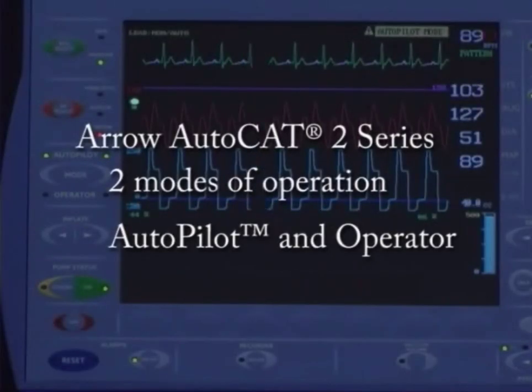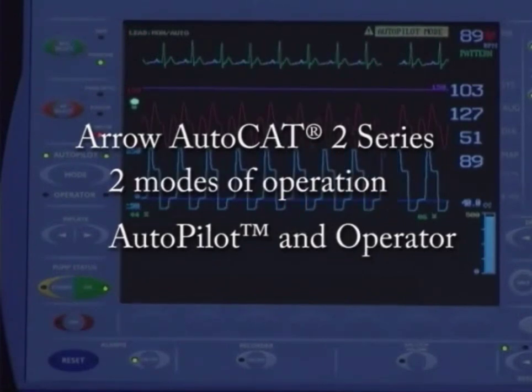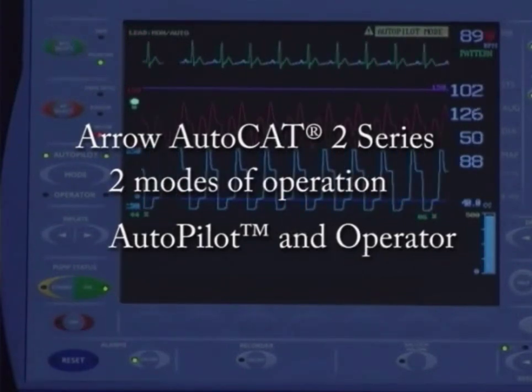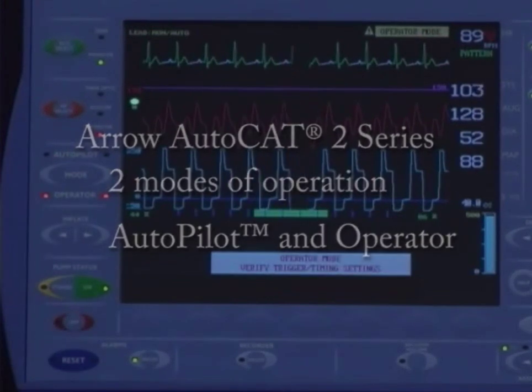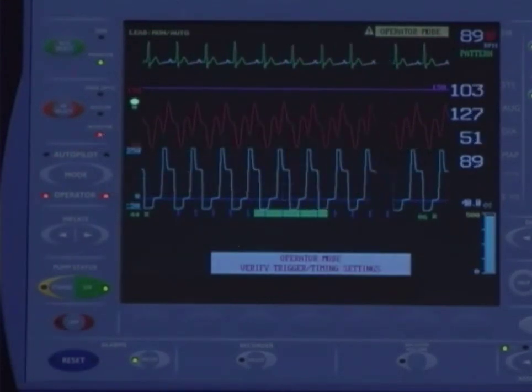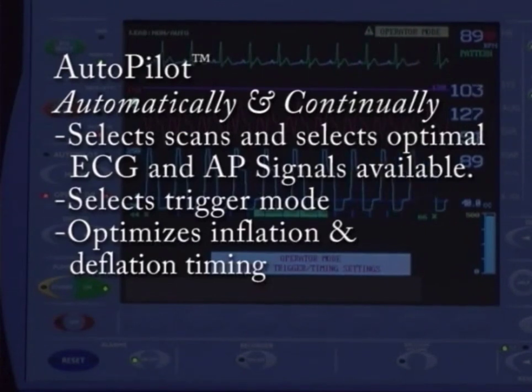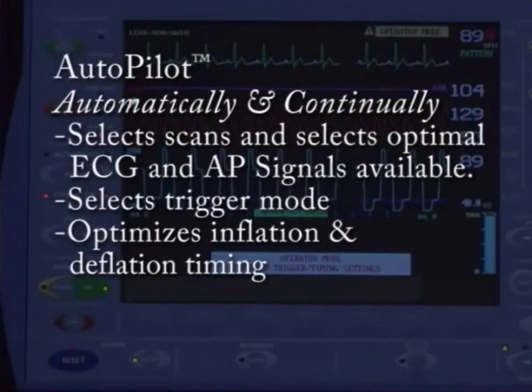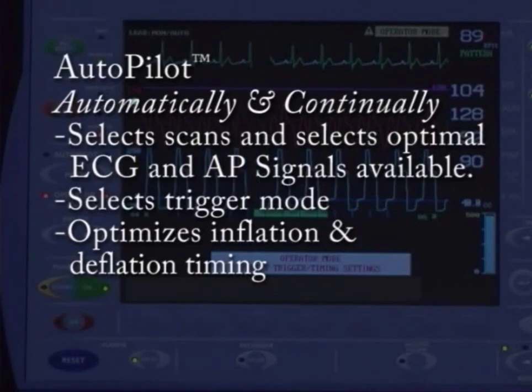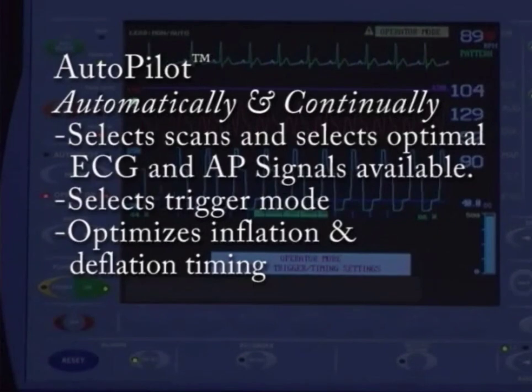The Arrow AutoCAT 2 series offers two distinct modes of operation: AutoPilot and Operator. AutoPilot mode puts the pump in charge of all of these functions for you, allowing you more time to spend with your patient. Arrow's AutoPilot features automatic ECG and AP signal recognition and selection. Automatic ECG lead selection uses best signal analysis. It will choose the appropriate trigger and timing method based on a patient's condition and signals connected, and will maintain optimal timing.